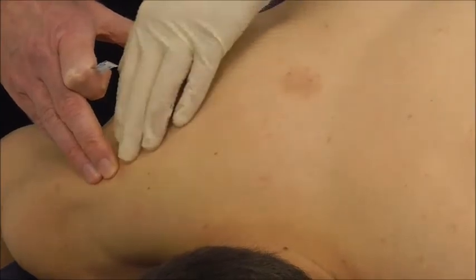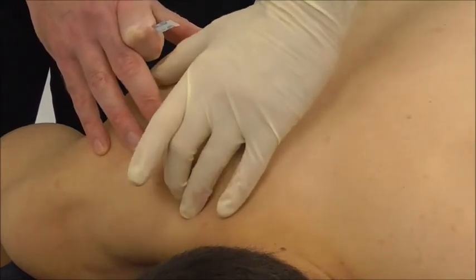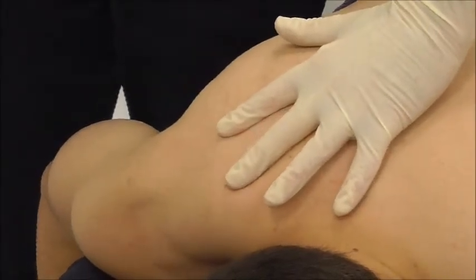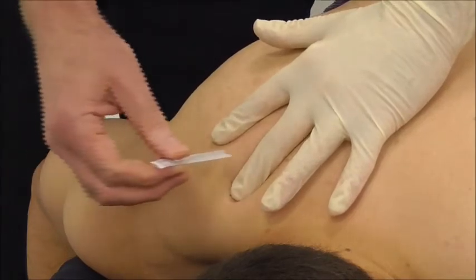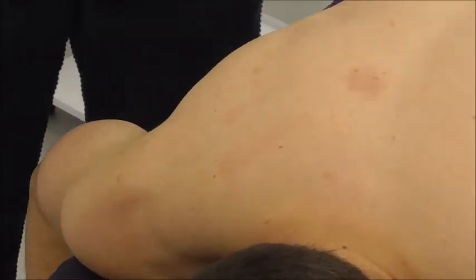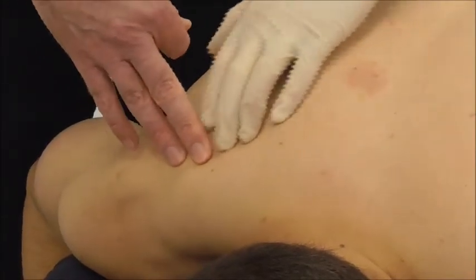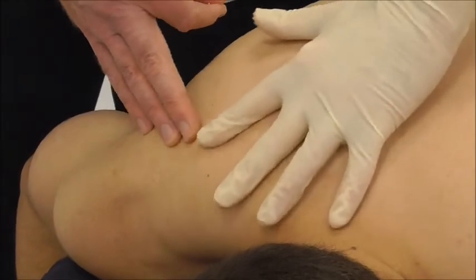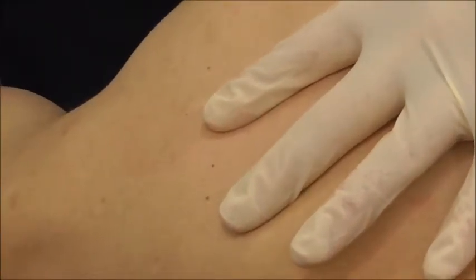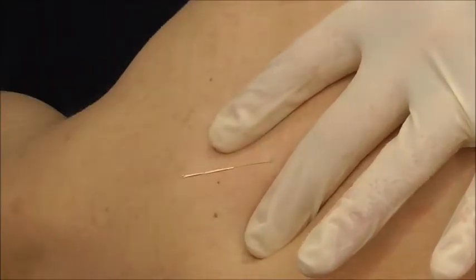I've found the sharp edge, which is the spine of the scapula. Going deeper, the additional edge I feel is the superior border. I'm going to have one finger on the spine of the scapula and the other finger compressing into the muscle, then angle my needle going towards bone — at about 20 degrees to the skin surface, with the needle tip heading towards bone. I keep my finger on that bone to confirm correct position, one finger on the spine of the scapula, one finger above it where the supraspinatus is resting, compressing down and angling the needle towards the scapula spine.